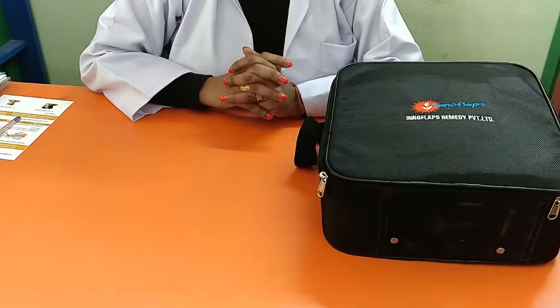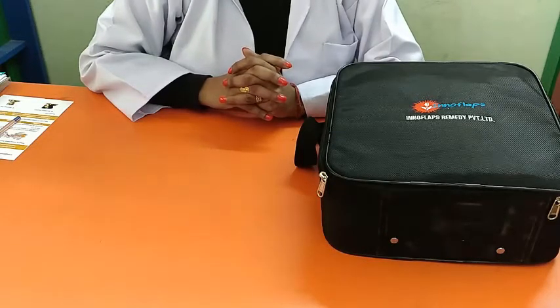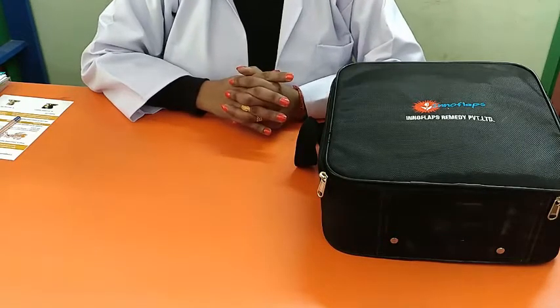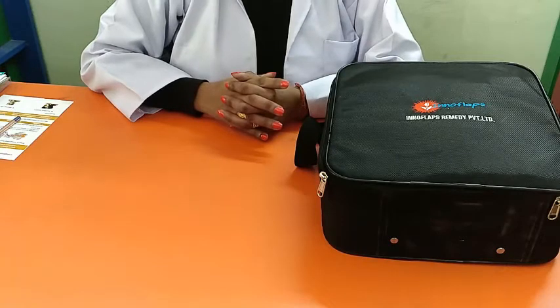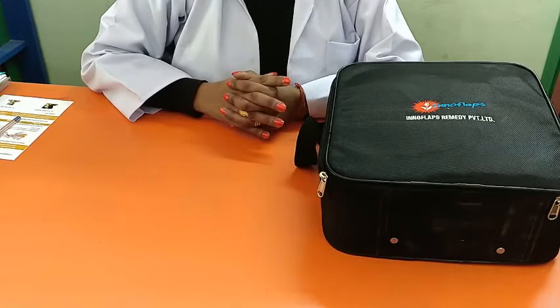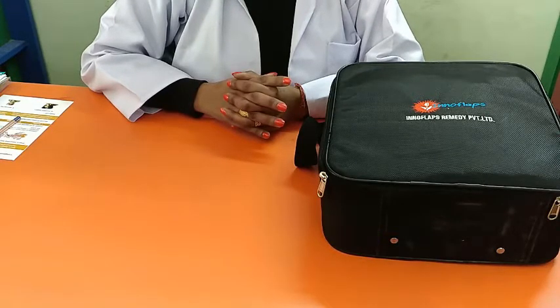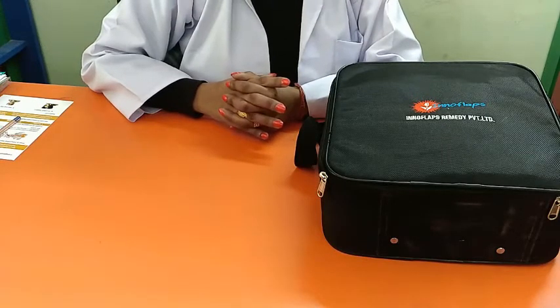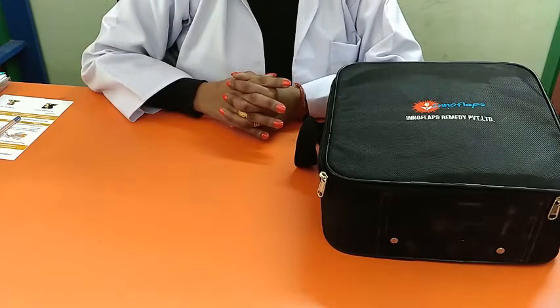This device is useful for parents, professionals, and special educators. It requires very less training, which can be done through video call or via sending a CD. The parents, professionals, or special educators can do speech and language training at their clinic, at their school, or at their home easily.